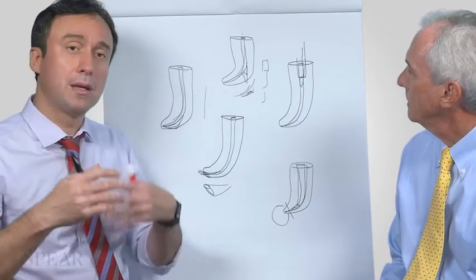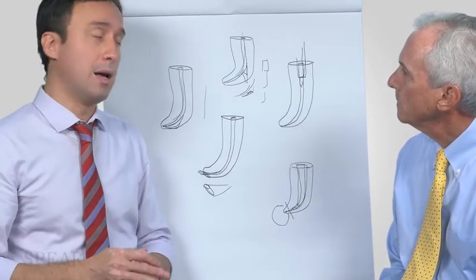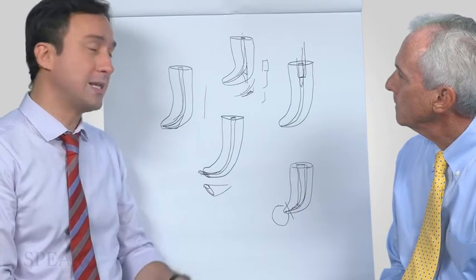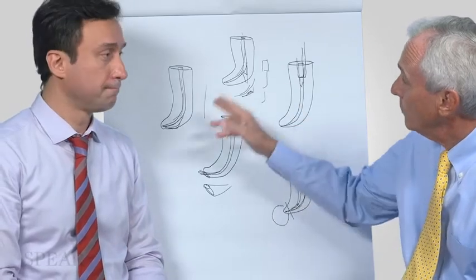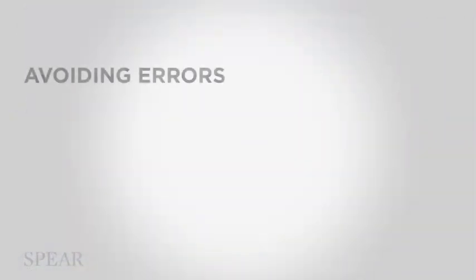But you have to keep the big picture in mind that trying to remove every separated instrument may not be the right thing, non-surgical removal, because it could actually damage the tooth more. So, the most important way to avoid all these problems. Yes. Light touch. Light touch.